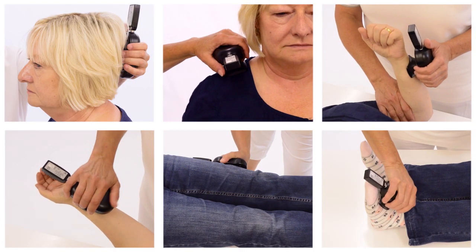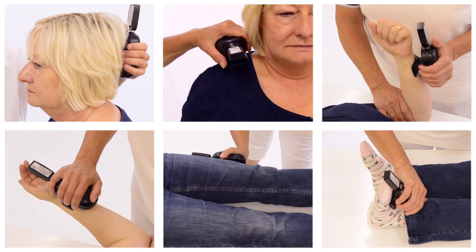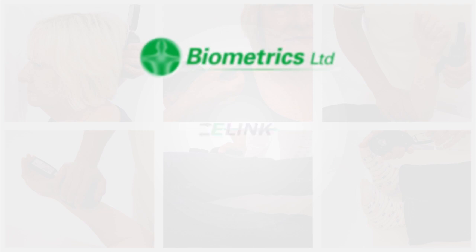The myometer accommodates tests on the neck, shoulder, elbow, wrist, hip, knee, or ankle. It is the perfect solution to effectively evaluate the strength of individual muscles or muscle groups needed to perform essential functional movements.